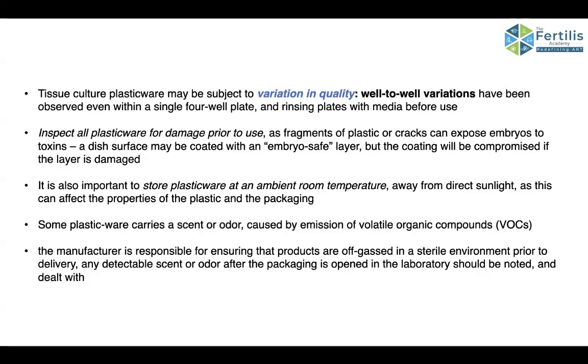So tissue culture plasticware is subject to variations in quality. In a 4-well dish, an 8-well dish, or a 6-well dish, well-to-well variations have also been seen in the same dish. So you have to inspect all the plasticware for damage prior to use.